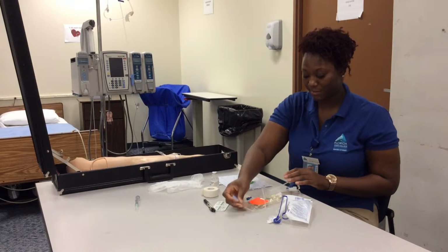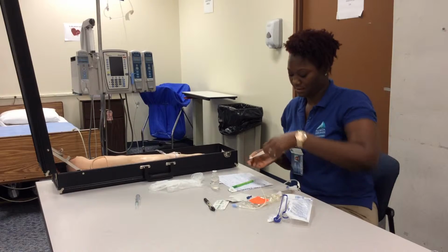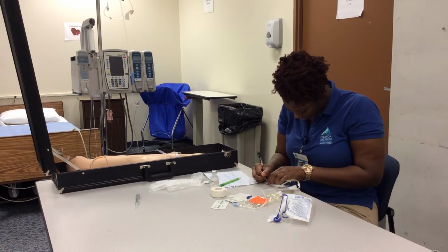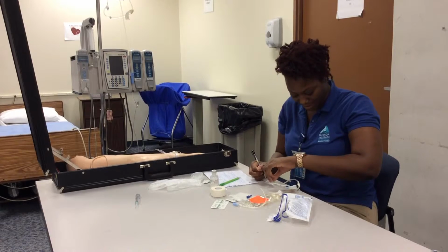Now I'm going to prepare my tubing. Alrighty, so now I'm going to label my tubing with my initials, time, and the date.